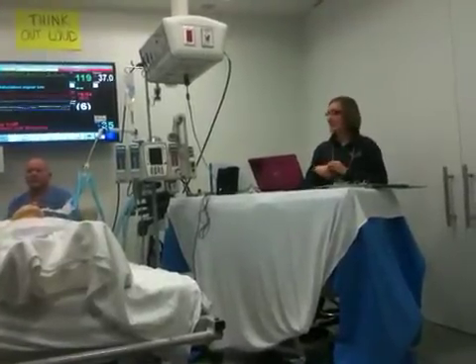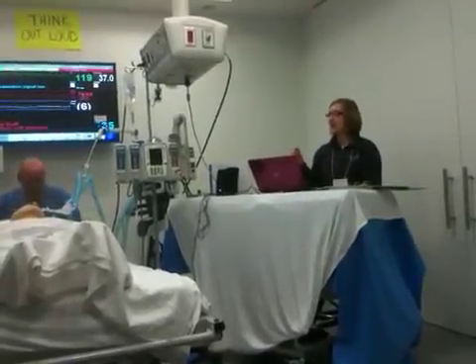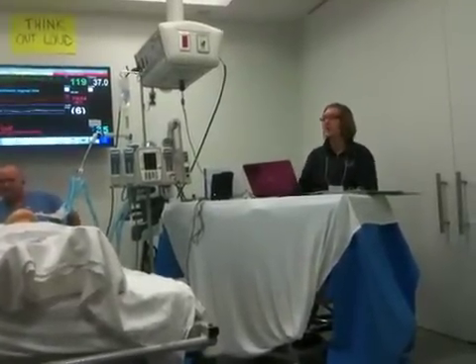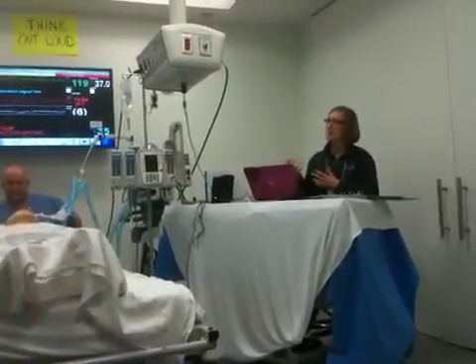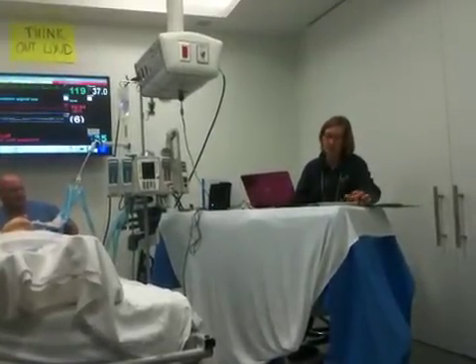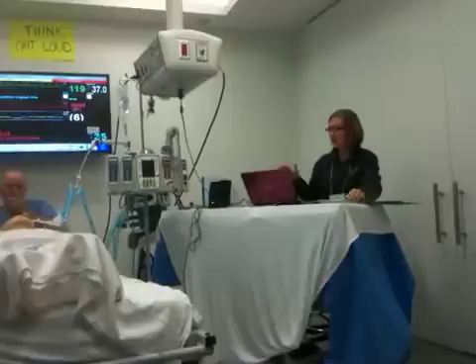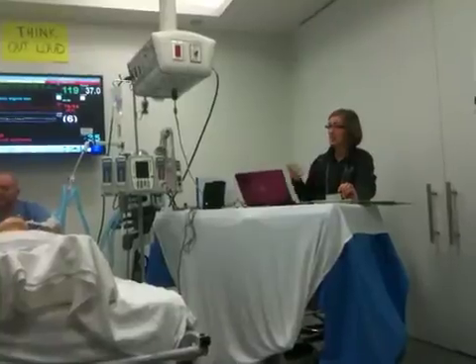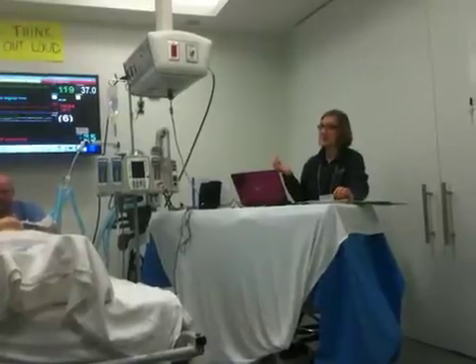But the reason that we did venous air again in this room is that in the other rooms there are arterial bubble detectors. And in this system, there is not a system that will alarm for you. And so, again, with the arterial air, venous air, it's the same principles. They were wanting to have the same kind of interactions. I do want to read for you just real quick the arterial air desired responses so you kind of hear what they were doing in the other rooms. For this room, there was really not a point to do arterial air, because what would have happened is we would have shot the arterial air in, it just would have gone to the patient because there's nothing to stop it from doing that, and then it would have circled around through and come back venous side anyway.